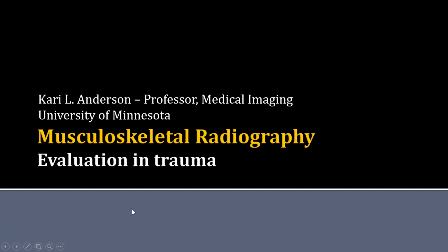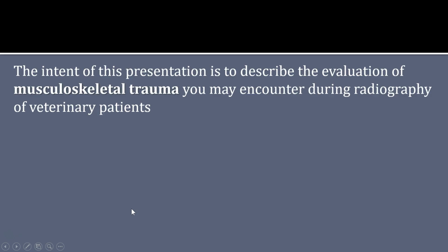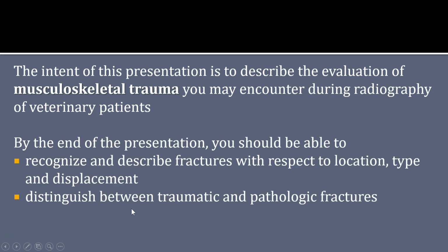This is the first in a series of presentations on the topic of radiography in musculoskeletal trauma and repair. The intent of this presentation is to describe the evaluation of the musculoskeletal trauma.